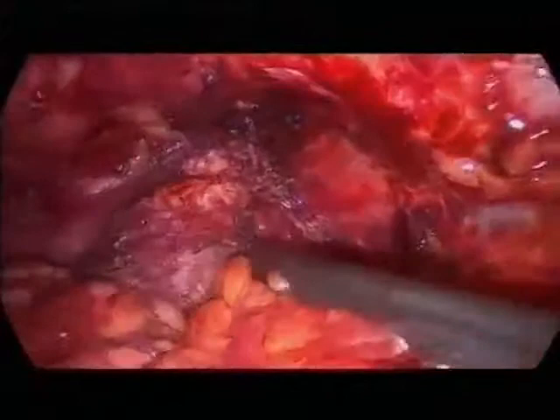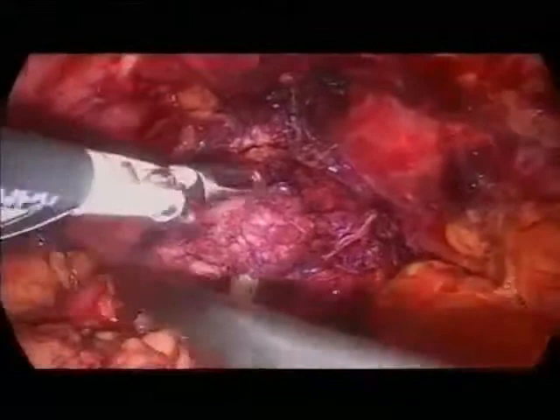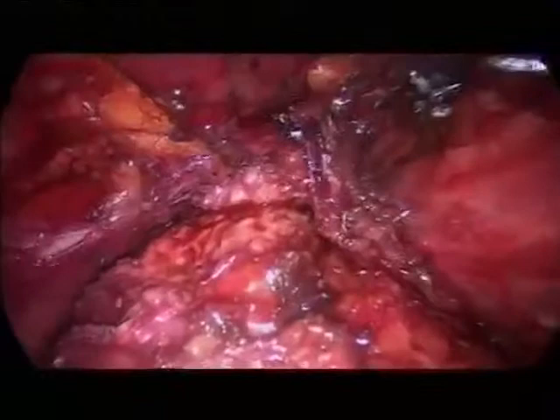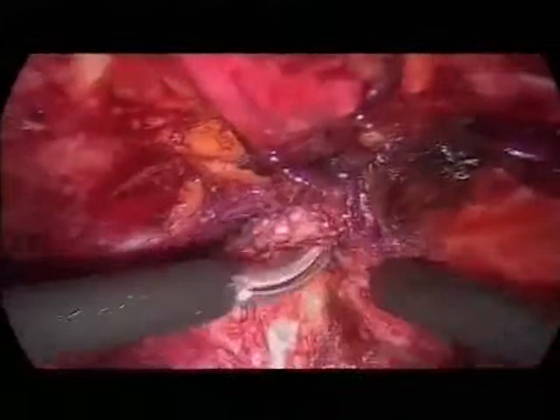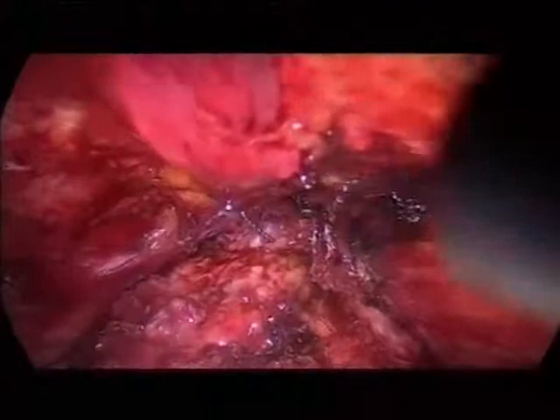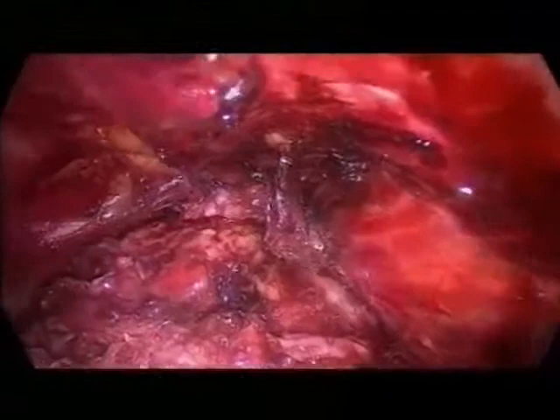There was a small node on the left side, but you see on the right side the dissection is done completely. We have the puboprostatic ligament at this point with the Santorini plexus. You see the fascia. The tissue of this patient is a little bit inflammatory. You see, we are dissecting the vein here. As you said, the apical dissection is very important. The patient is a little bit obese, but it doesn't matter.